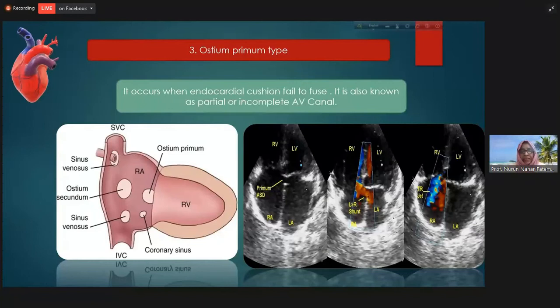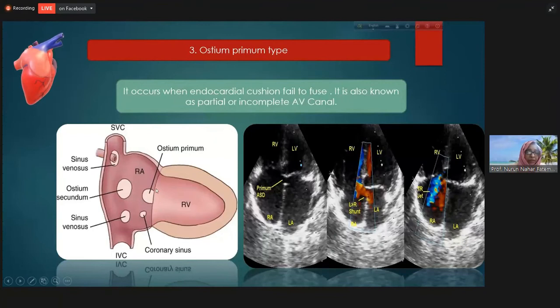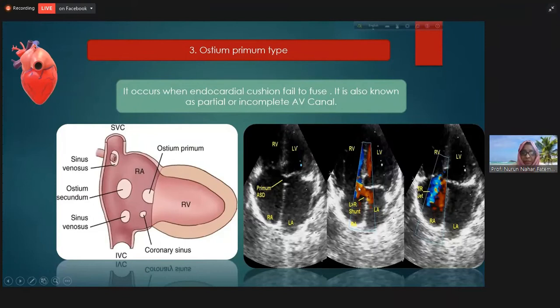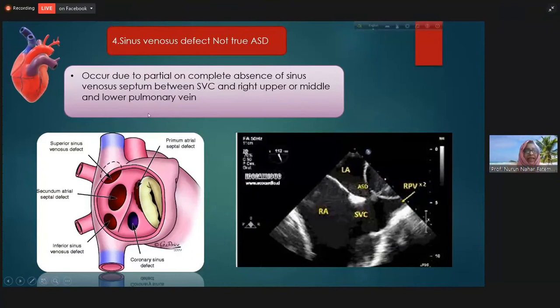The ostium primum is the endocardial cushion defect, derived from the endocardial cushion. You are seeing that this is the ostium primum, and sometimes this kind of defect is associated with the whole endocardial cushion defect, which is an AV canal type of defect.